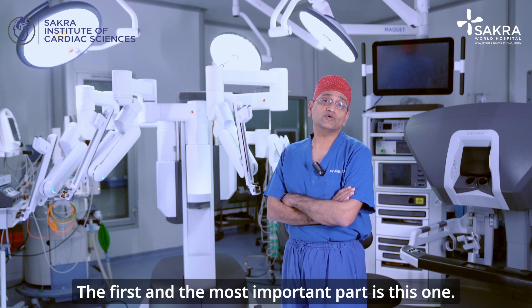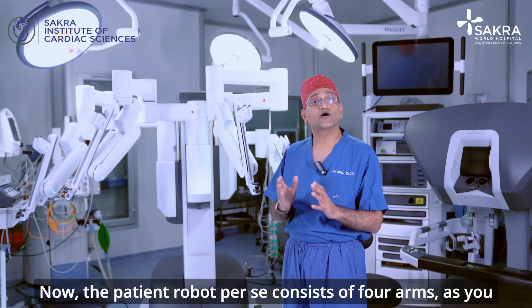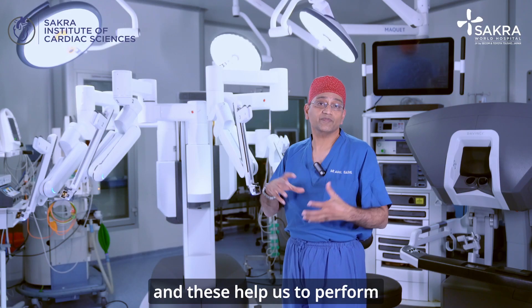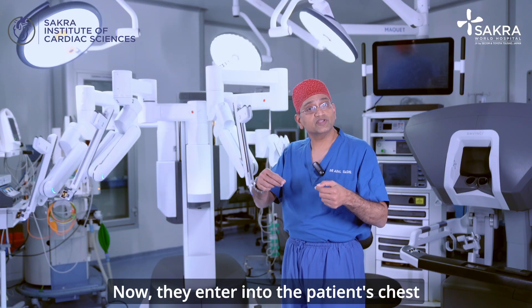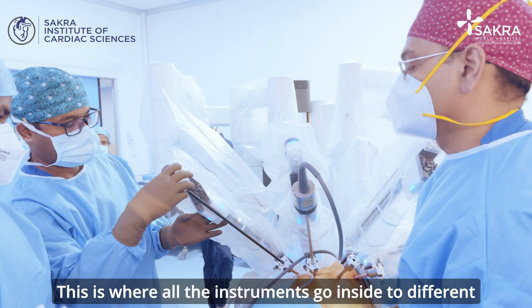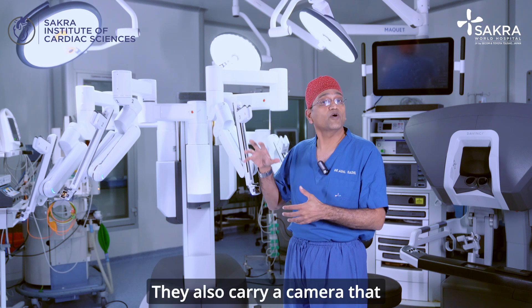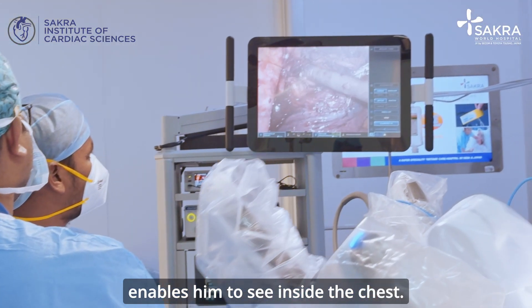The first and most important part is this one — the patient side robot. It consists of four arms, like the tentacles of an octopus, which help us perform the particular kind of surgery. They enter into the patient's chest through small pinholes that we call ports, where all the instruments go inside to different parts and corners of the chest to enable the surgeon to perform the surgery. They also carry a camera that enables him to see inside the chest.